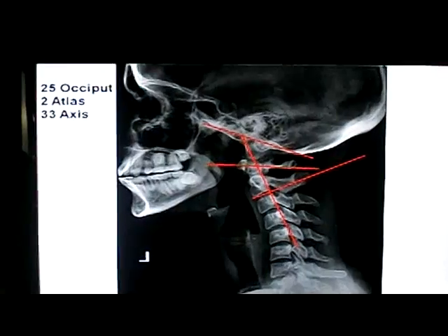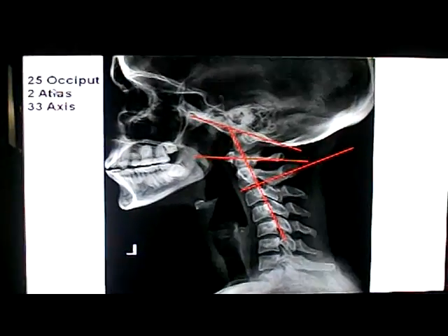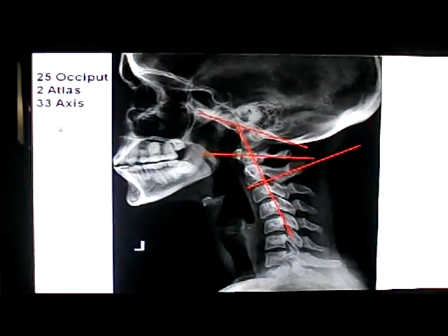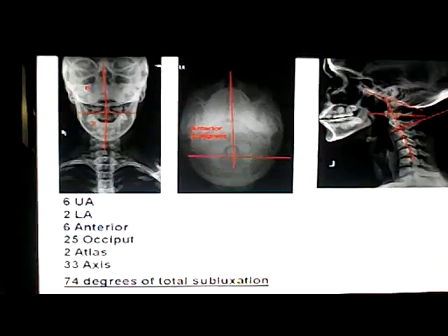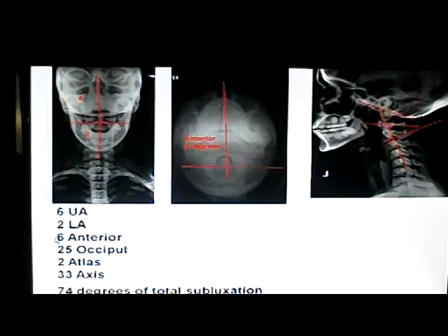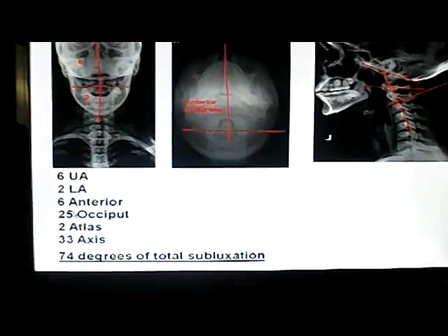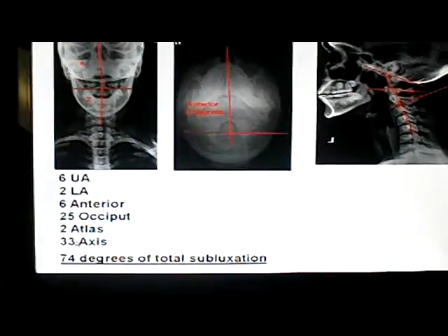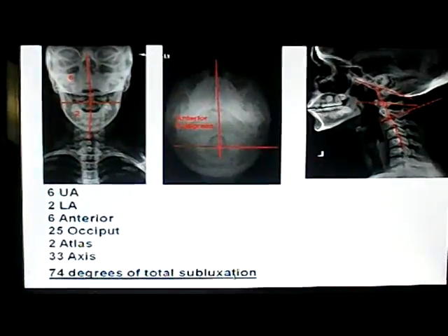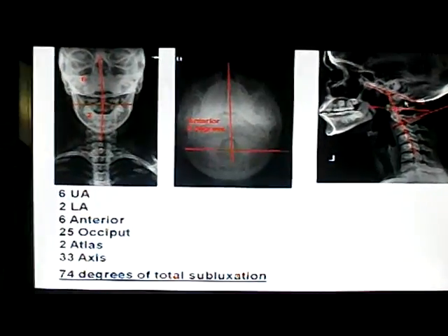Now, this is where it gets interesting. If we go ahead and add the misalignment subluxation of the occiput, which is 25 degrees, the atlas, which is 2 degrees, and then C2, which is 33 degrees — as we add those together, we see that we've got an upper angle of 6 degrees, a lower angle of 2 degrees, a 6 degree anterior rotation on the base posterior x-ray, 25 degrees subluxation of the occiput, 2 degrees subluxation of the atlas, and 33 degrees subluxation of the axis. So when we add all these up together, we get 74 degrees of total subluxation relative to the atlas, occiput, and axis at all 3 dimensions.